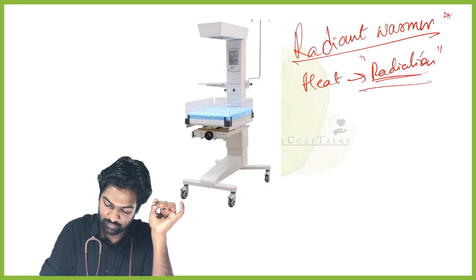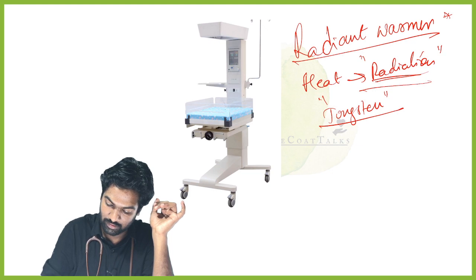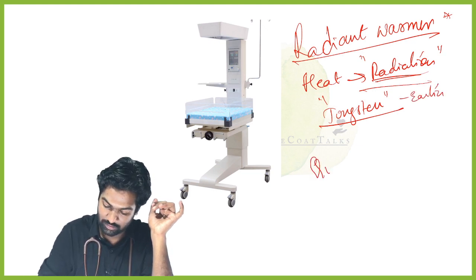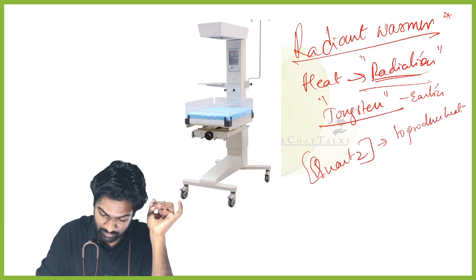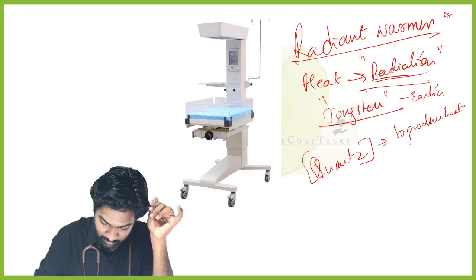Actually, this tungsten filament is what they used earlier. Nowadays, quartz crystals are utilized to produce heat, and you can see this. I'll draw it there. You can see this small square here.